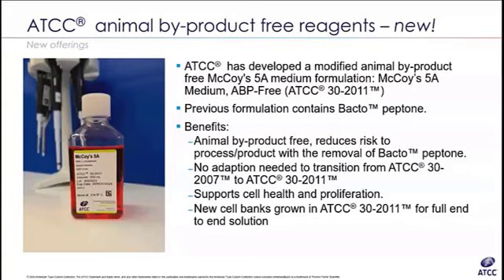Cell detachment can also be caused by the confluency and density of the cells in the flask. If you allow your cultures to become overconfluent, they will start lifting off, sloughing off, just because there are too many. And then finally, the concentration and the type of exposure to the dissociation enzymes used on the cells during subculture. If you don't properly inactivate the dissociation agent, your cells will fail to reattach, and you can get clumping cells, and those clumping cells may not reattach nicely and can easily lift off after subculture.